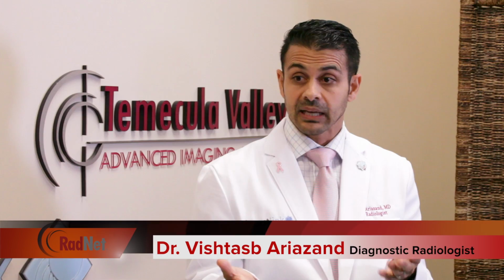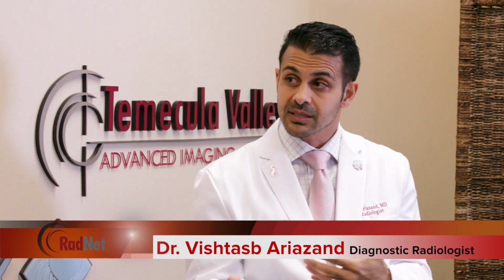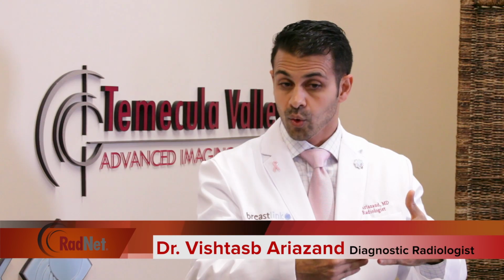Correct. Unfortunately, depending on where the implant is placed, it will dictate how much of the breast tissue you can see. Because they can place the implant in front of the pectoral muscle, or they can place the implant behind the pectoral muscle. If it's behind the pectoral muscle, that's when we're able to see the majority of the breast tissue. Okay, good. And then also, the way that they put the implant in, either in front or behind the muscle, how does that affect it?